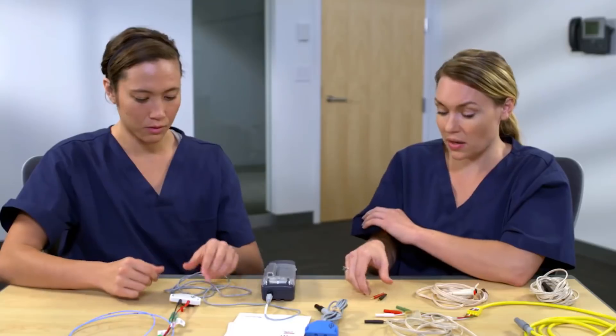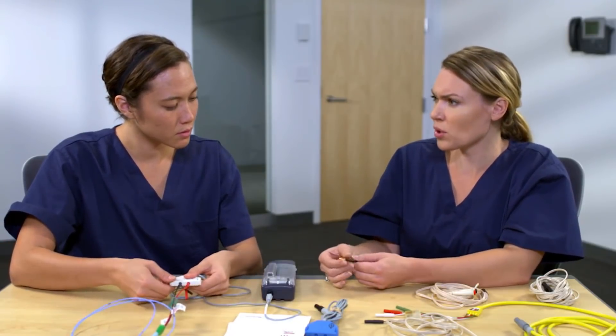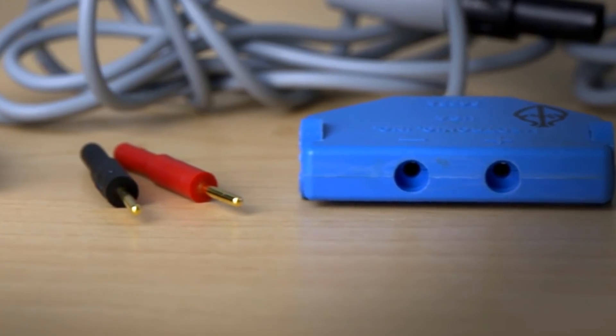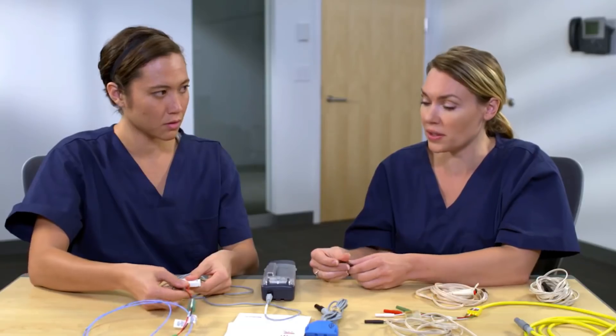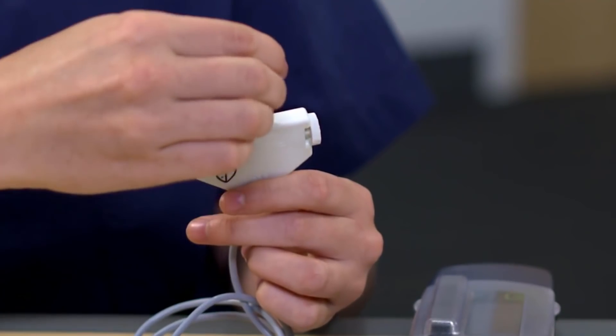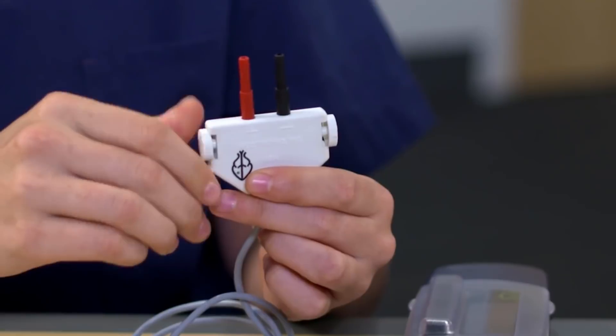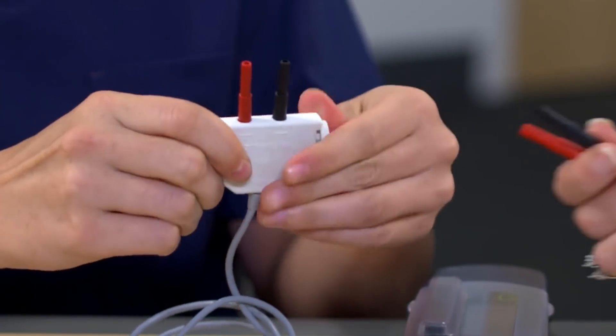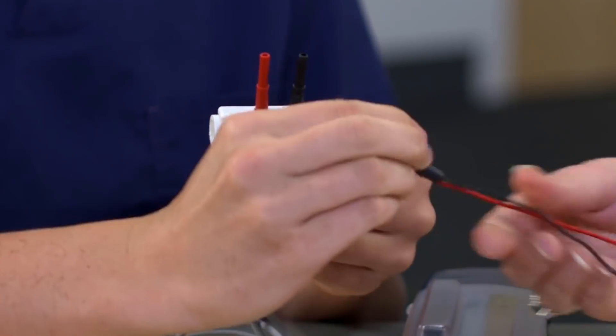You can also connect this cable to a pacing lead with shrouded pins — you just need to use the adapters. These adapters or something similar come packaged with the leads. You'll connect the adapters to the cable, then connect the shrouded pins on the lead. Tighten them in, and then connect the shrouded pins to the adapters.